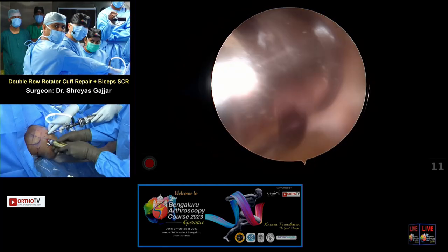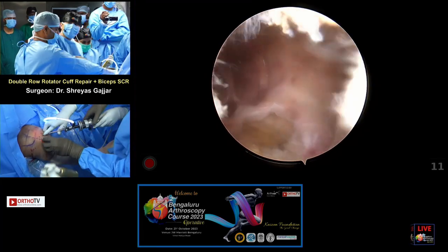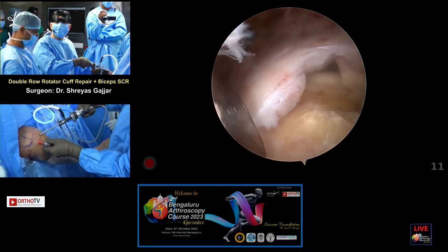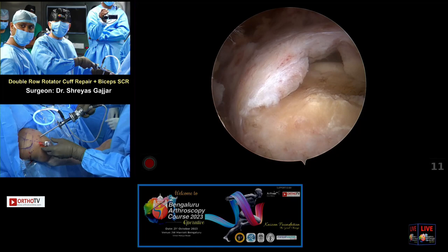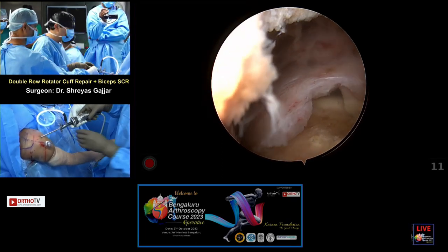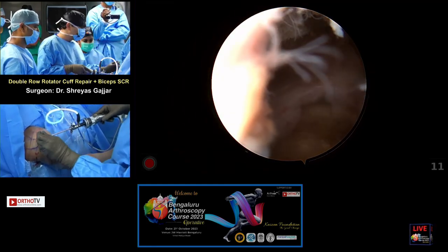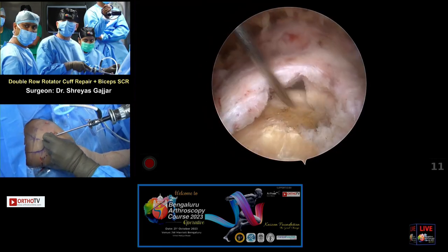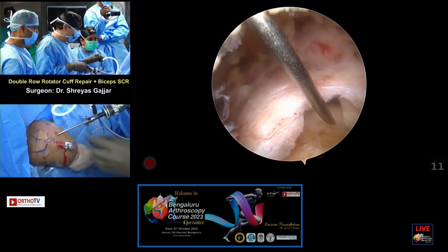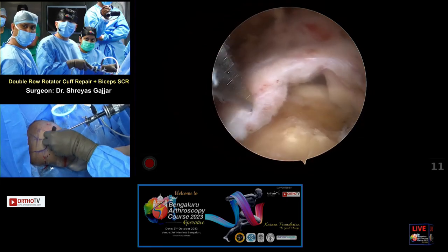So we are passing the triple dam cannula, as you can see here. Again, one tip: I'm going to use the scorpion self-retrieving suture device, so you have to keep the cannula very close to the lateral part, otherwise it will not allow the instrument to be maneuvered. So now, can I have the needle, please? Now, anchor insertion. If you have the outside image, go flush with the lateral part, and you can see this is a good trajectory. Anywhere between 45 to 90 degrees is good. So take it off, please. Can I have the trocar, please?